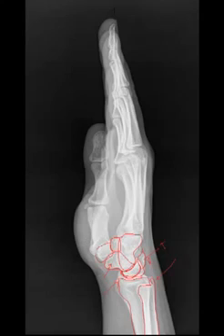Now, as you can see, all the digits as well as all of the metacarpals are stacked on top of each other. So this is not a great view to see them individually. However, with any type of forward or backward displacement or angulation of fractures, this view can be very useful to evaluate direction. Also, if you're concerned about volar plate or dorsal plate fractures of the phalanxes, this is also useful. You can also separate the fingers while taking this view and fan them out so you can see the digits individually in a lateral perspective as well.